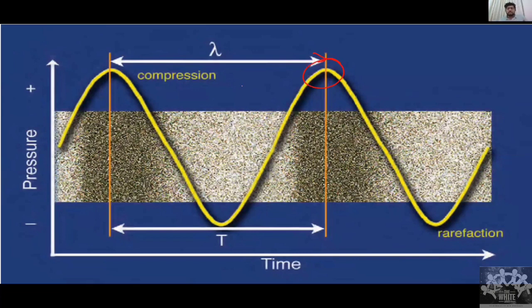that means the distance covered by the sound per unit time. So frequency is nothing but the number of peaks per unit time, and how far each peak travels is decided by the wavelength. So this will give us the speed. Okay. So we need to understand that the speed is equal to frequency into wavelength. This is the first thing that we need to understand. That's one principle.